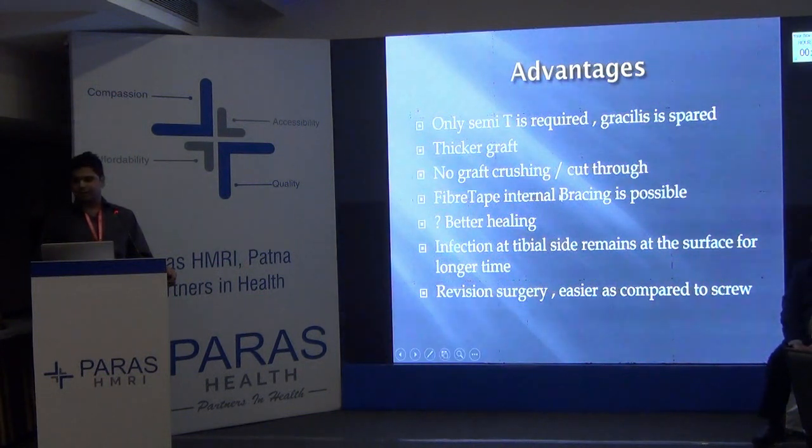No risk of graft crushing through the screw. If the screw is not very blunt, it might actually cut the graft. Fiber tape internal bracing, if you are very fond of this technique, then you can use fiber tape as a seat belt mechanism with the same fixation device. You need not add any additional device on the tibia for your fiber tape.